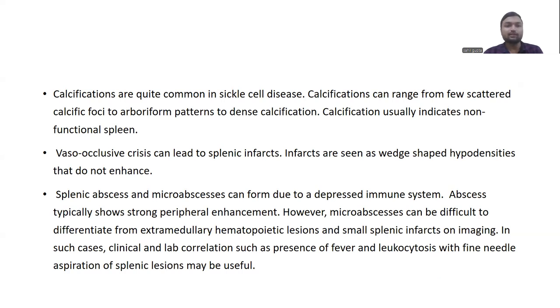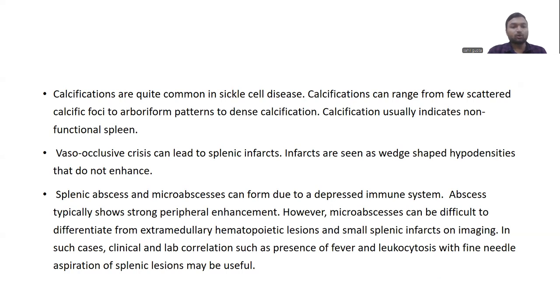Calcifications are quite common in sickle cell disease and can range from punctate scattered calcific foci to arboreal or lace-like patterns to dense calcification. Calcification usually indicates a non-functional spleen. Vaso-occlusive crisis can lead to splenic infarcts, seen on imaging as wedge-shaped hypodensities that do not enhance. Splenic abscesses and micro abscesses can also form due to a depressed immune system. Abscesses typically show strong peripheral enhancement; however, micro abscesses can be difficult to differentiate from extramedullary hematopoietic lesions and small splenic infarcts on imaging.